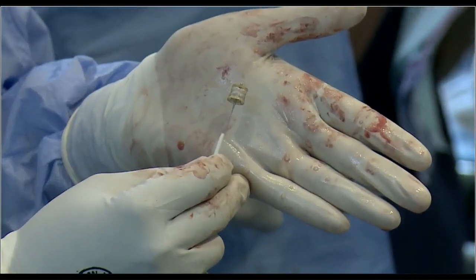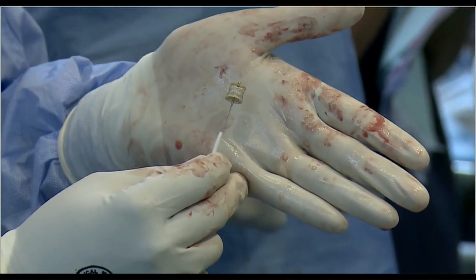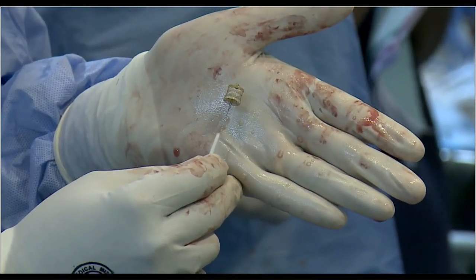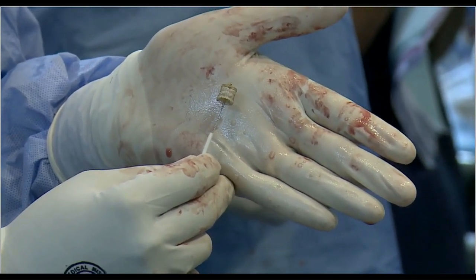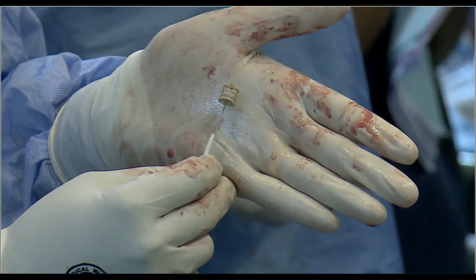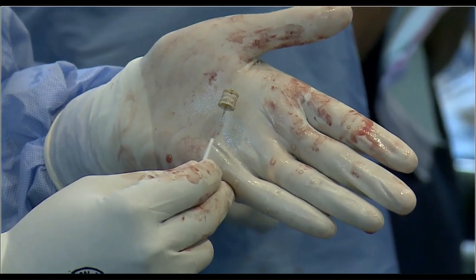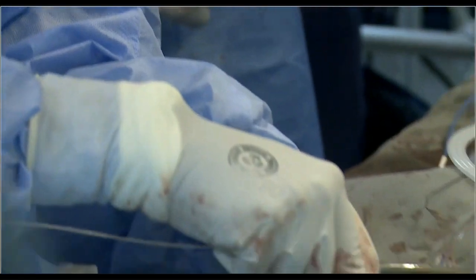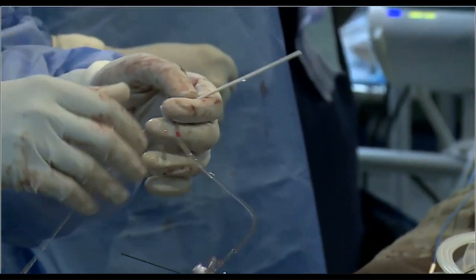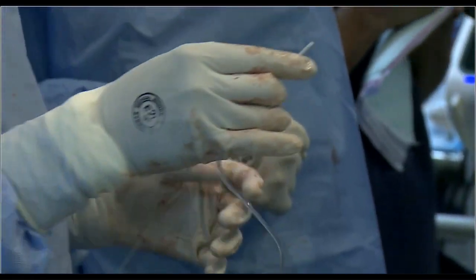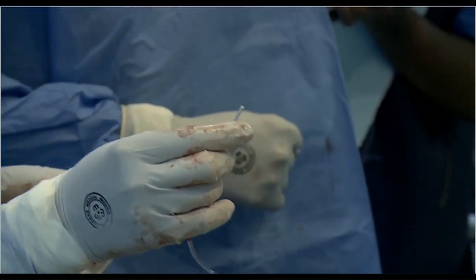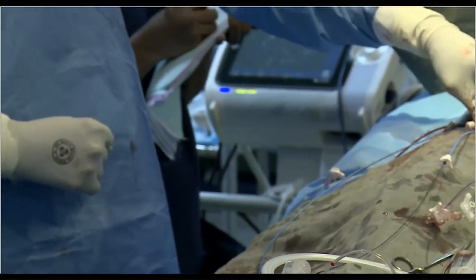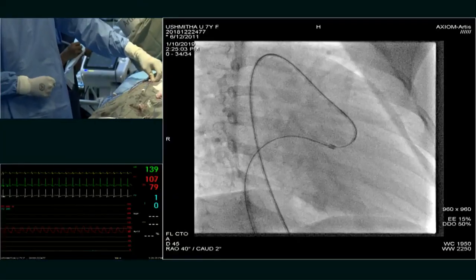This is a vascular plug made by Lifetech. It has got three layers of fabric, single lobe — AVP-1 type, 10 millimeter. I am choosing 10 millimeter because that narrow portion — the vessel size was 4 to 5 millimeters — so I am doubling the size.